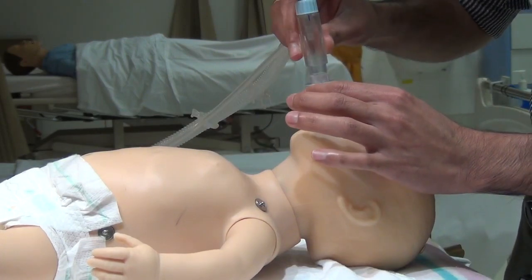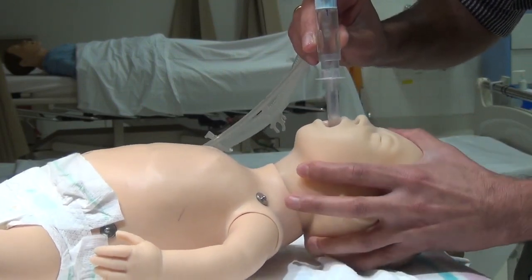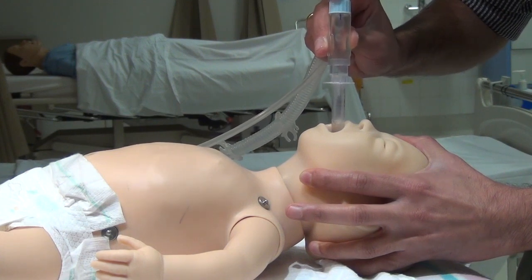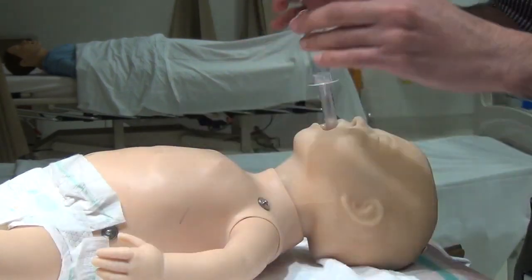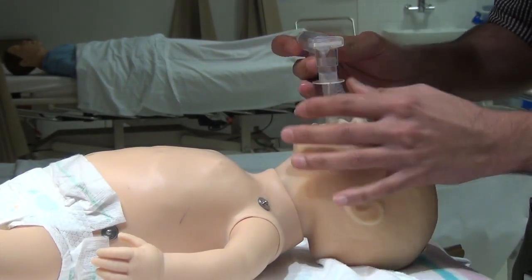Attach Neopuff and start ventilation. Watch for chest movements. You can also attach a colourimetric CO2 detector, which will change from purple to gold if the placement is correct.